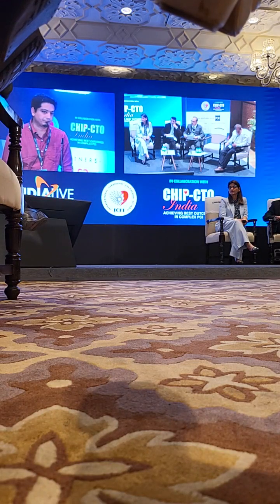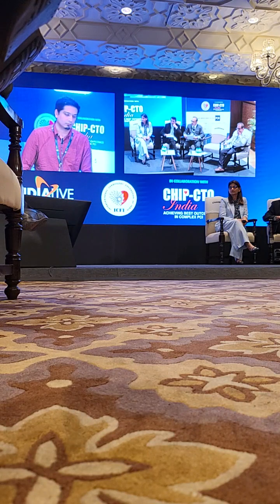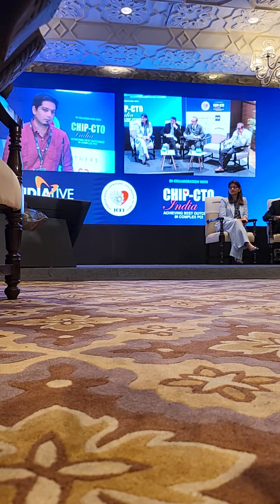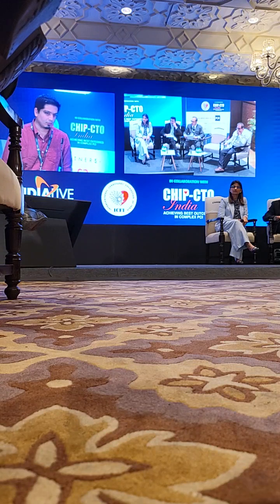And the third thing I feel is important for budding interventional cardiologists is that we should be very gentle and soft towards the guiding catheters. Especially when you have a long left main, your guiding is going to get stuck in. So always make it a habit of keeping the guiding, especially the EBU, extra backup support, pulled out. Whenever you are pulling the balloon out, it is going to get stuck down. So when you are pulling the balloon out, disengage the guiding for some time.